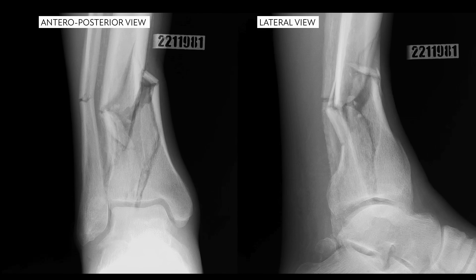Now let's take a look at the conventional radiographs of the ankle. You can see an AP and lateral view of the ankle, and if you analyze it critically, you can see that the fibular fracture is transverse and simple.